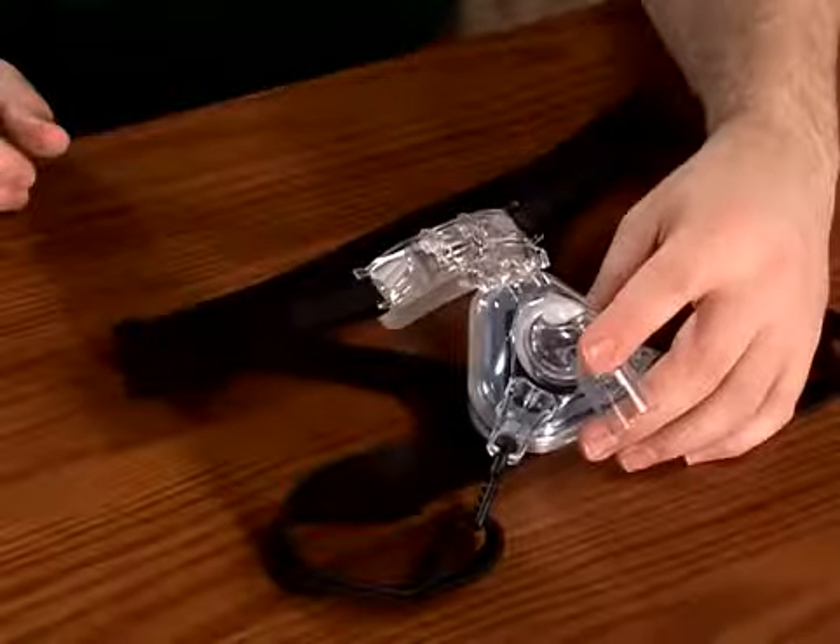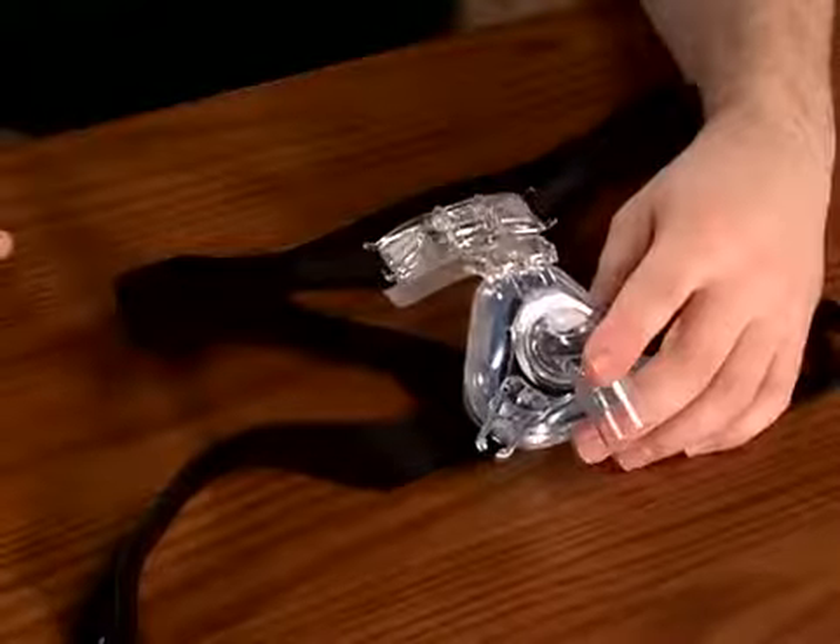To make it easier to place the mask and headgear on your face, disconnect one of the ball and socket quick clips from the faceplate socket.